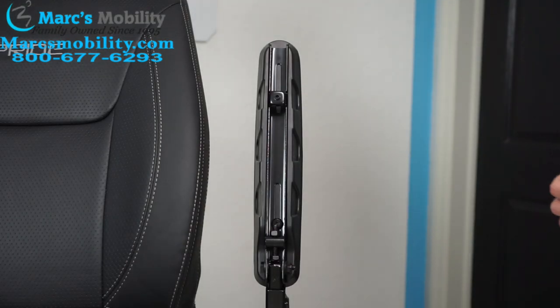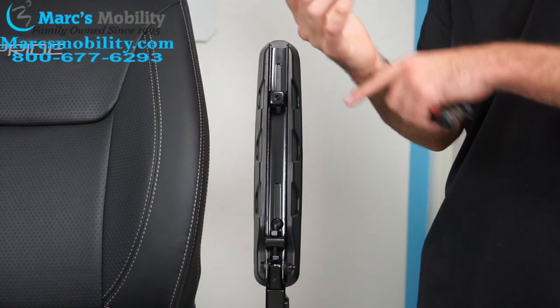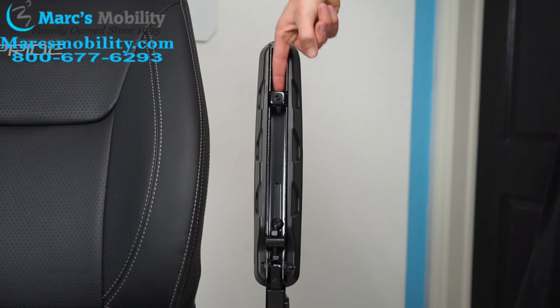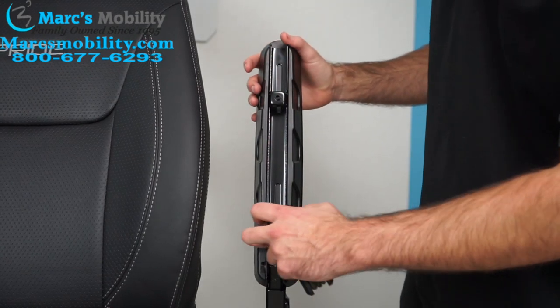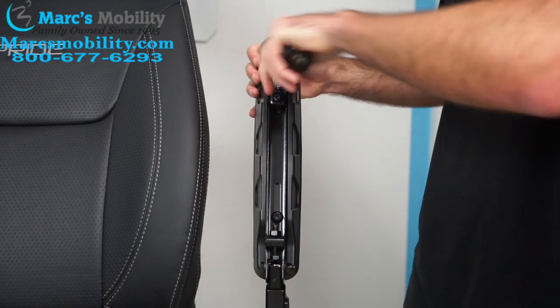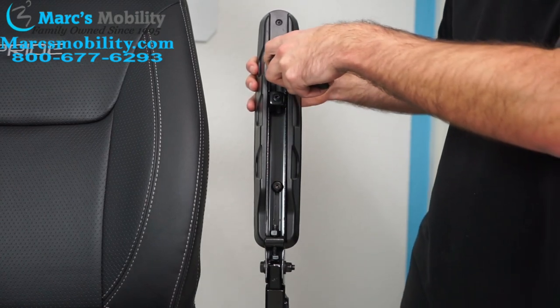The next adjustment we're going to make is extending the arms. The arms on the Jazzy Air 2 can slide up if you need more space to rest your arms. They're a little short from the factory, so I recommend extending them. We're going to do that by loosening these two Allen screws right here. Once loosened, the arm will slide forward, so push it all the way forward and then tighten the screws again.